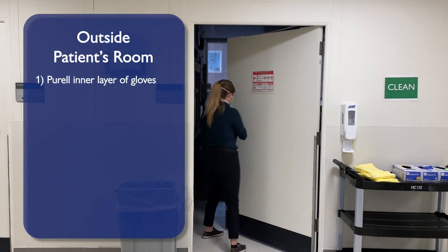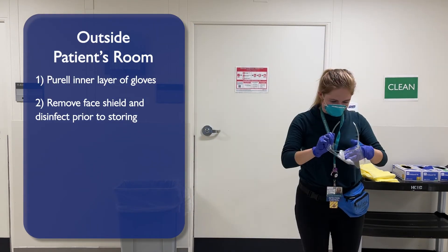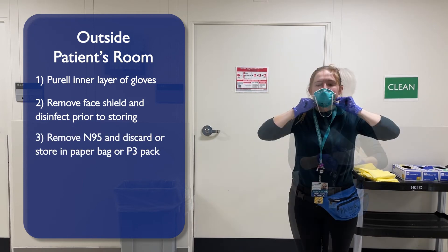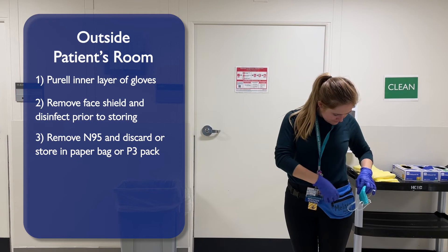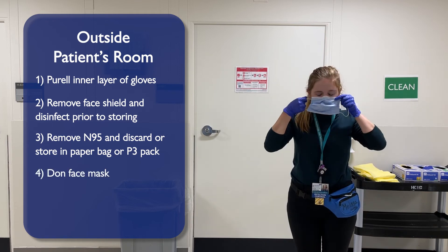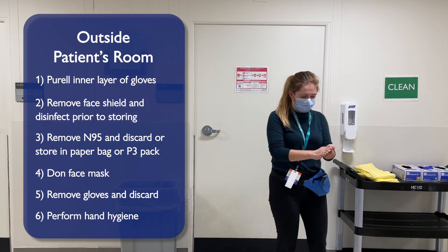Outside the patient's room, Purell your inner layer of gloves. Remove your face shield and disinfect prior to storing. Carefully remove your N95 and discard or store in your paper bag or P3 pack. Don face mask. Remove your gloves and discard. Perform hand hygiene.